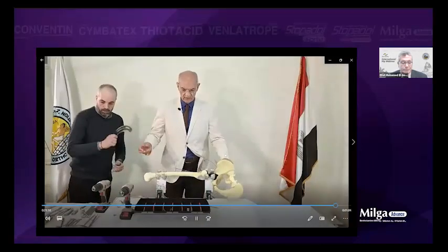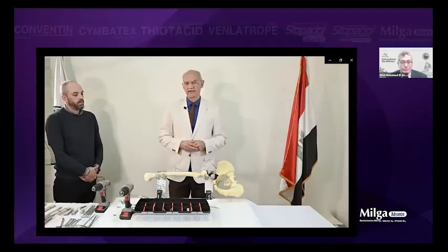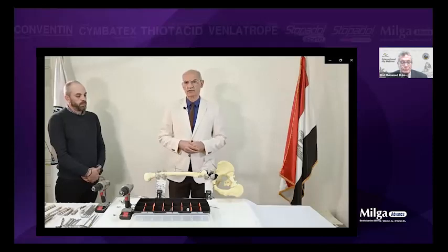So in conclusion, you can treat fracture neck femur, trochanteric fracture, subtrochanteric fracture, cases of malunion of the proximal femur, non-union of the proximal femur, infected non-union of the proximal femur. You can apply external fixator, and you can use the closed reduction techniques using the external fixator. You don't have to do any open reduction.